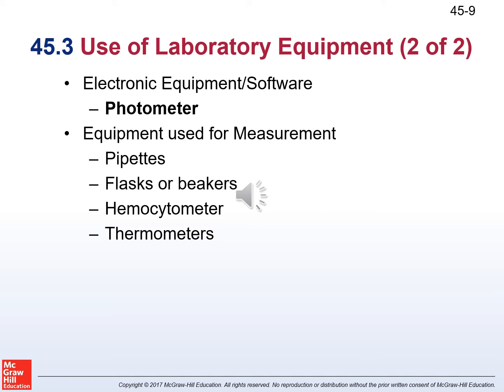Electronic equipment is used in the POL because it is safer, more accurate, and more efficient than manual methods. Tasks such as cell counting and complex chemical analysis are performed with electronic equipment. A photometer measures light intensity and is present in a handheld glucometer to measure reflected light.